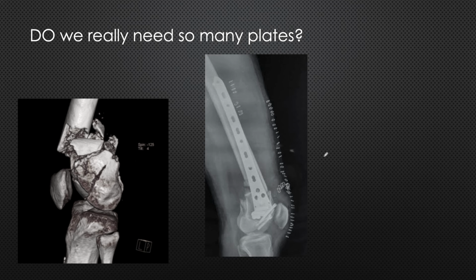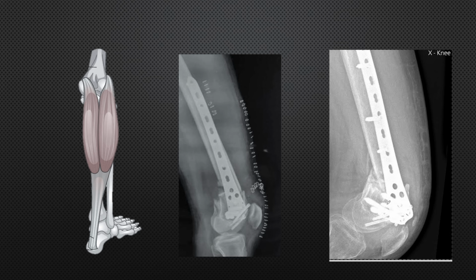So this is an example. Here you see there is a similar kind of fracture pattern. There is extensive comminution in the articular zone, but the surgeon has tried to be biological. He had tried to plate on the lateral side and fix these fragments with multiple headless cancellous screws. Again, I told you, this part has not been utilized with any plate. So ultimately this was the outcome.